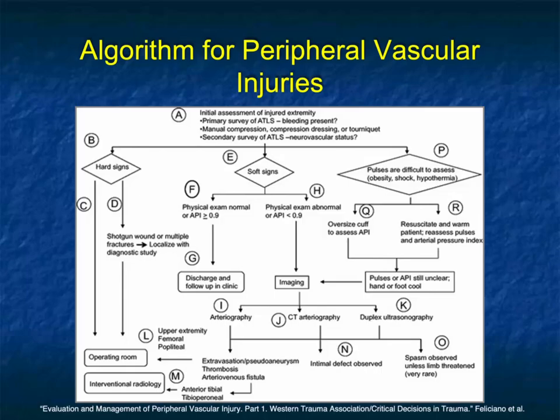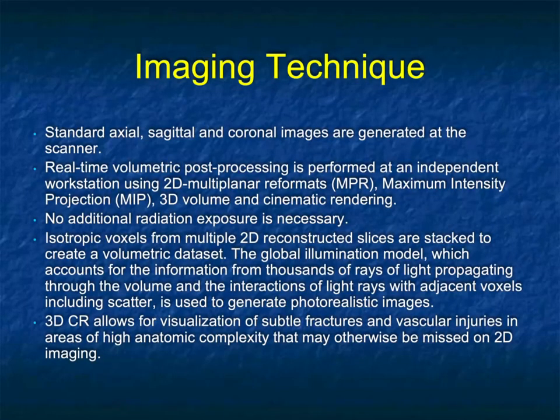And I won't go through it, but you can see how imaging is a central component of what we do, particularly CT angiography, and how that decides specifically how the patients will be triaged. Now, in terms of imaging, imaging is everything.